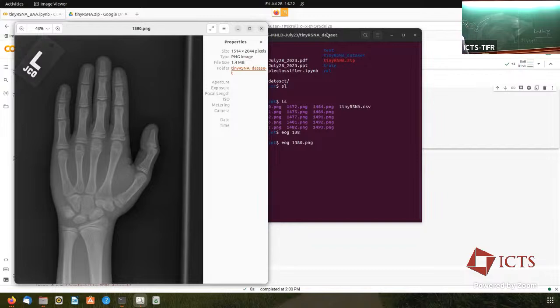Now, there's a couple of ways to do it, right? You could take the entire data set that you have and make a step based on the entire data set. You compute the loss with respect to all the points. You take one, find the loss, take another image, find the loss, take every point in the data set, find the loss, add up the loss, that's your total loss. Use gradient descent based on that entire batch. One way to do it. Can you come up with 2 more ways to do it?